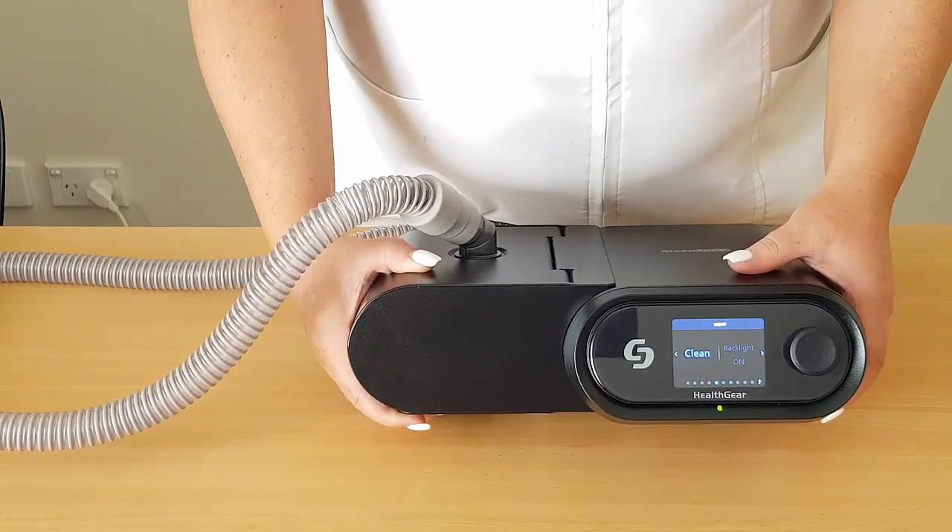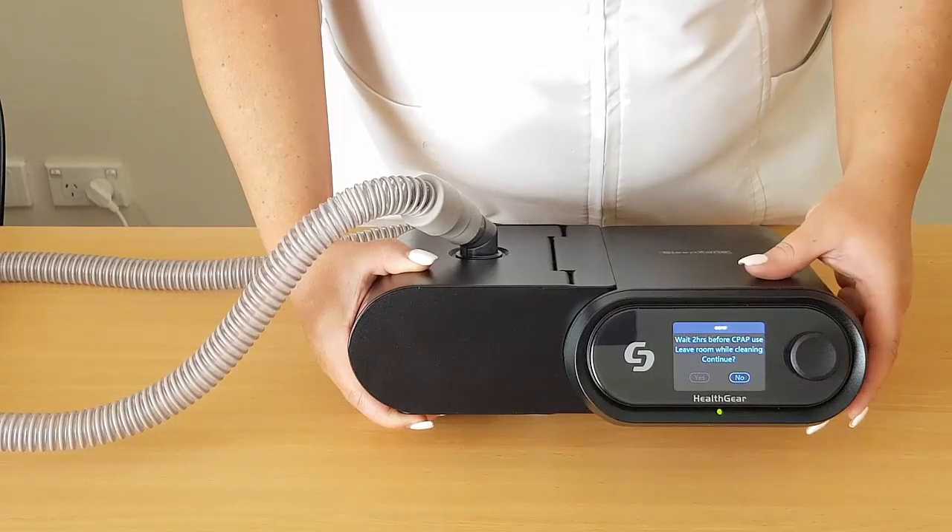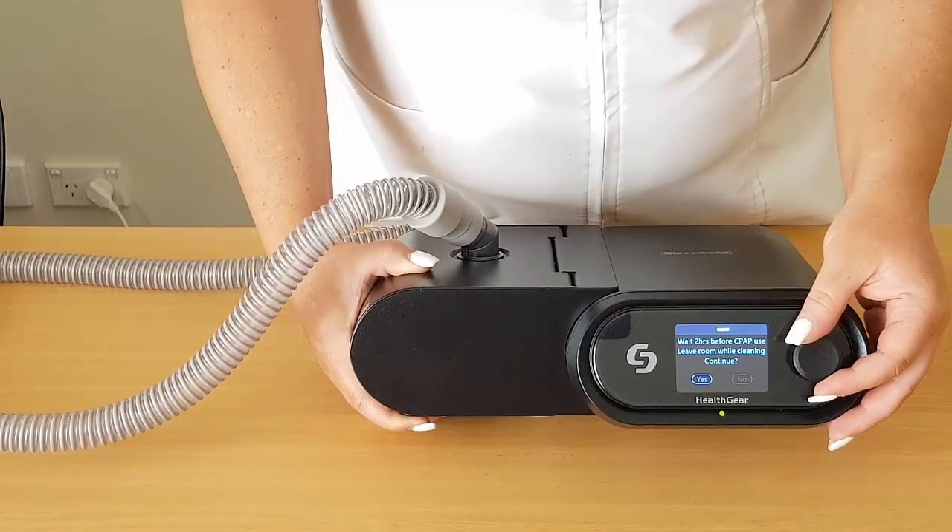To start the clean process, press your control dial and follow the on-screen prompts. The process will take 30 minutes.